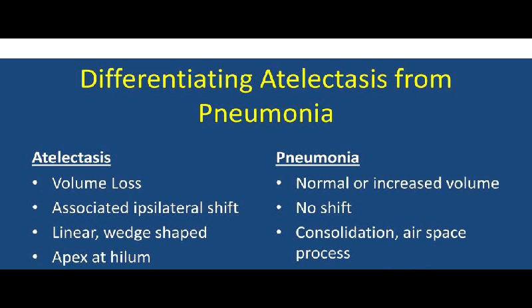Now, in atelectasis, I told you that is when there is volume loss.